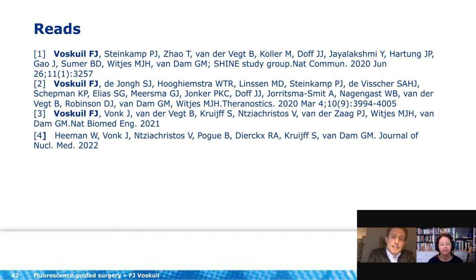Yeah, that's a good question as well. In theory, yes. We know that the higher wavelengths, called the NIR-II area, which starts from around 1,000 nanometers, face a lot less scattering. Currently there are not that many devices able to detect those far and near infrared wavelengths. We are performing a study now using NIR-II, of which the first results will be presented at the European Molecular Imaging Meeting in Greece a month from now. So then I hope to speak to you more on this topic.